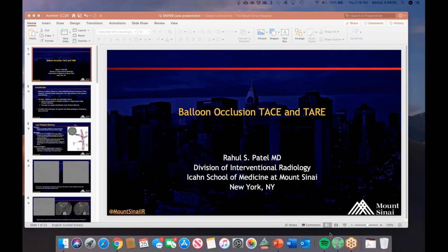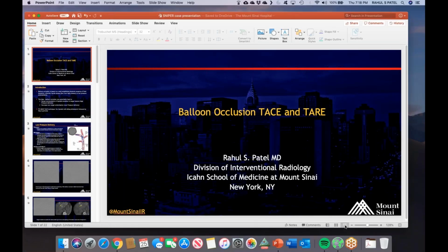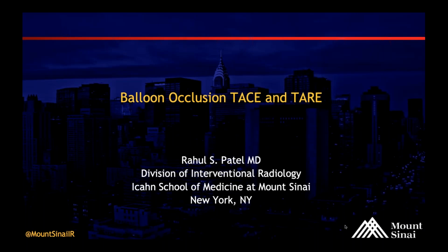Perfect. Okay, so I'm going to talk about a slightly different topic here. I'm going to talk about balloon occlusion catheters in TACE and TARE. So just a little bit of introduction.